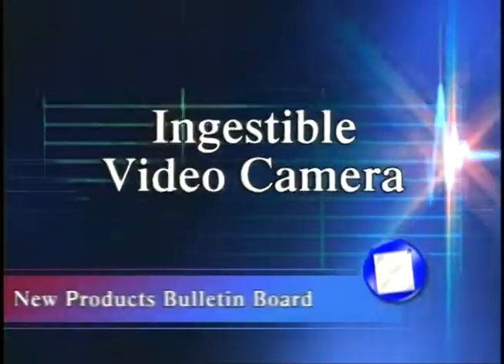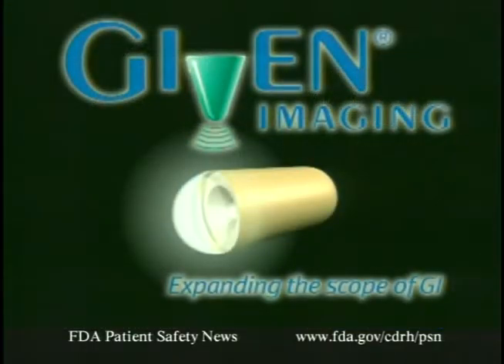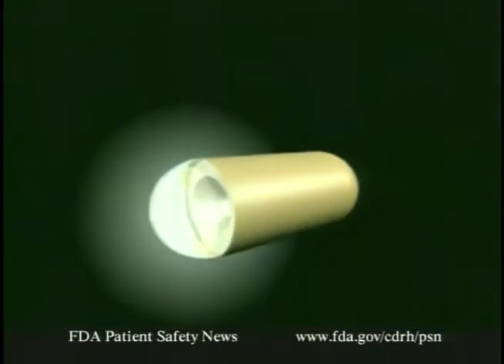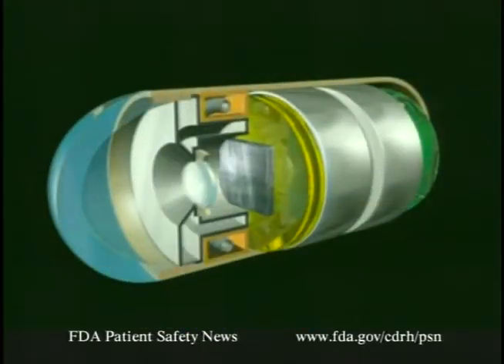First up today, our new products bulletin board, where we talk about some new devices that FDA has recently approved. The FDA has recently cleared a tiny video camera that a patient can swallow and that will take video pictures of the small intestine. It's called the Given Diagnostic Imaging System, and it's made by Given Imaging Limited of Norcross, Georgia. Here's how it works.